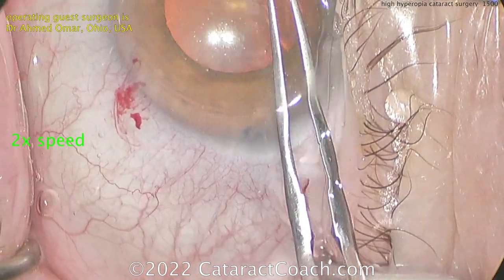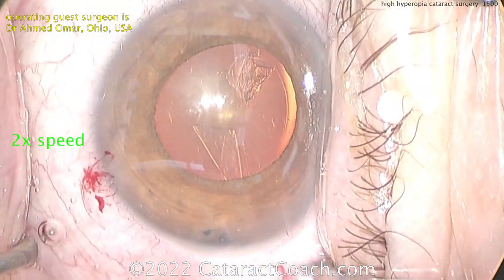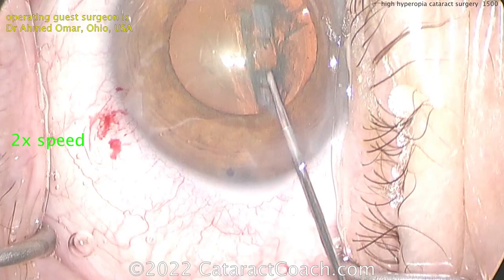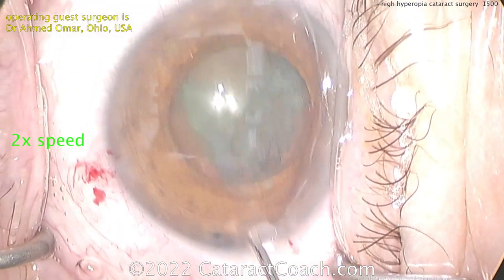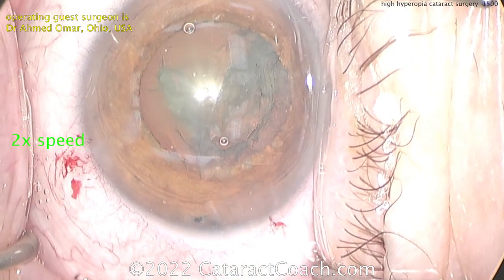It's a little bit off screen, but at the end you'll see it is completely round and intact — a really nice-looking rhexis. If you do need to stop and put in more viscoelastic, do so. Here's the hydrodissection using a specialty cannula. Be very cautious — do not prolapse the nucleus out of the capsular bag in a case like this because the AC is so shallow. Just enough hydrodissection to get it freed up, with a little extra aliquot of viscoelastic going in at the beginning.